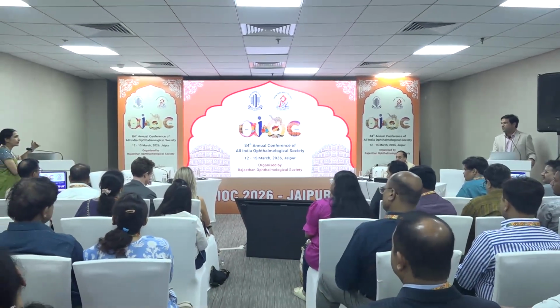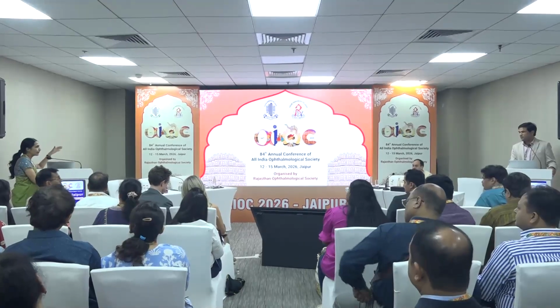taken care of those. Sir, I think this is a very relevant topic and you really amply covered all the points. But the main thing is, as you very rightly showed, preparing and knowing. I think it's very important that we should not be seeing the IOL powers on the day of OT on your chart. So the previous day we all should be preparing and looking at the axial length, the AC depth and the IOL power, all three, so that you know.